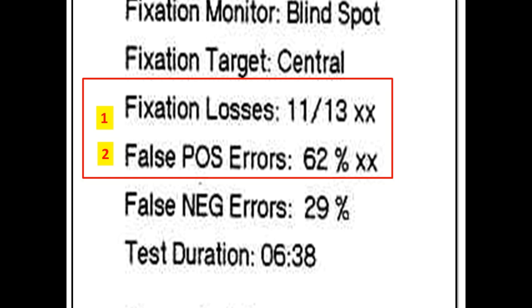The patient will respond to a stimulus in the blind spot location and artifactually cause a high fixation loss rate flagged as XX, and also a high false positive response flagged with XX.